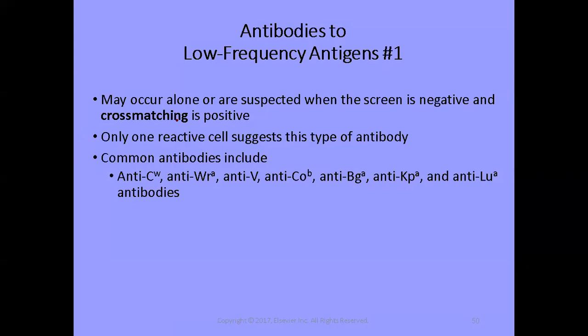When we have someone in need of a transfusion, we call that person the recipient. And so if we have an ABO compatible unit of red cells that we're thinking of transfusing in that patient, we can take some of those red cells and make a 3 to 5% suspension of them and test them with the recipient's plasma. It's just like every other tube testing, same quantity. So it would be 2 drops of my recipient's plasma and 1 drop of the donor red cells, 3 to 5% suspension. And we're going to look to see if they agglutinate, okay? So we don't want them to. With the cross-match test, negative results mean it would be okay to transfuse these cells in the person.